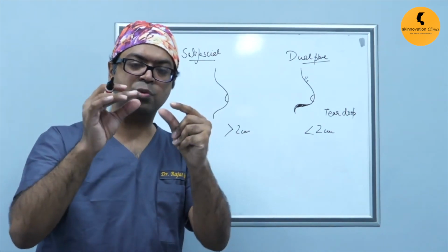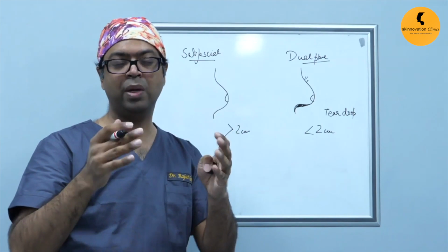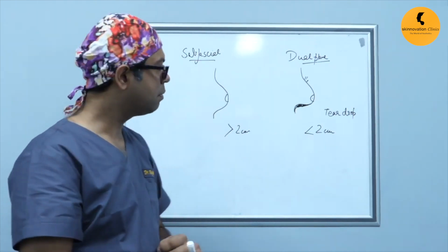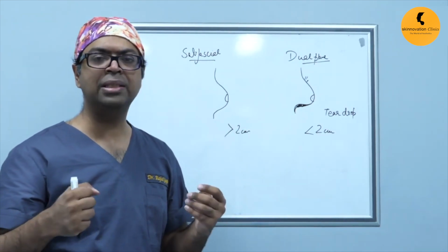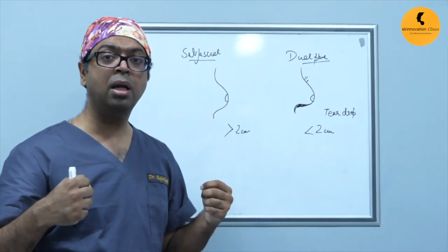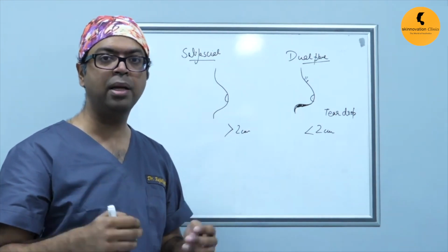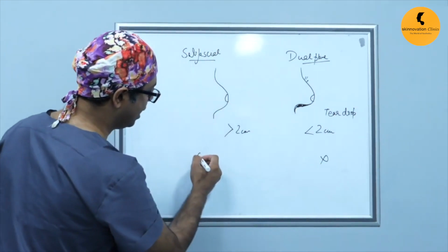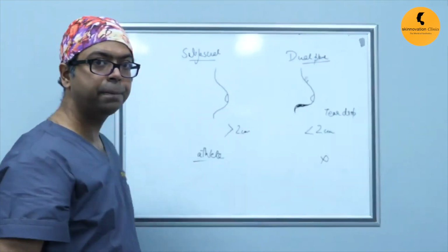If the skin thickness is very thin, one needs much more covering of the implant, otherwise it looks unnatural. The third thing is, if someone is an athlete, someone who uses their pectoralis muscle much more commonly in their day-to-day life, a sportswoman, then one should not go for a dual plane. An athlete should go for a subfascial implant.